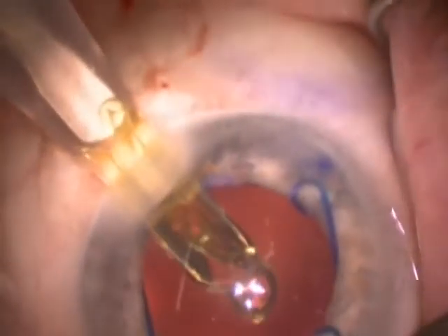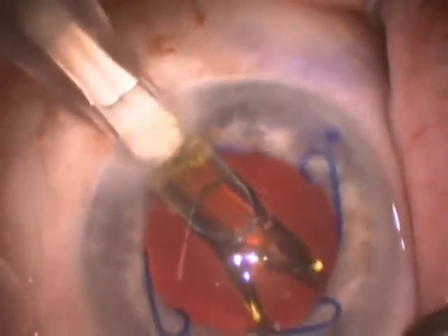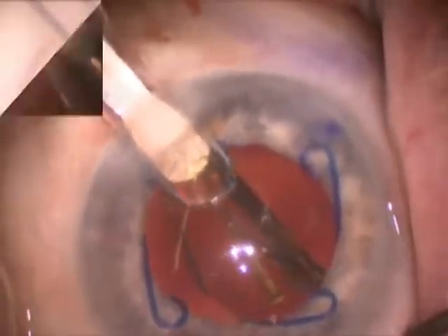Should be very smooth as it goes in. Now if that leading haptic comes out, it's not a big deal. It's just the trailing haptic that you want to really make sure is tucked in.